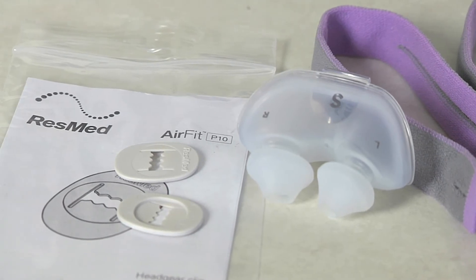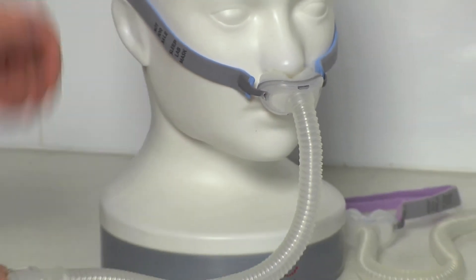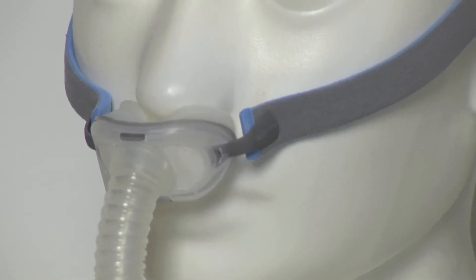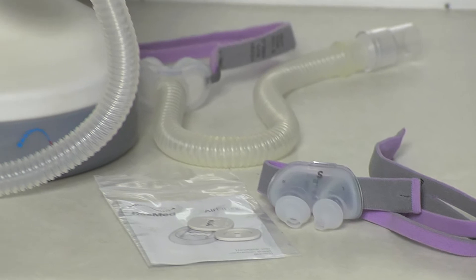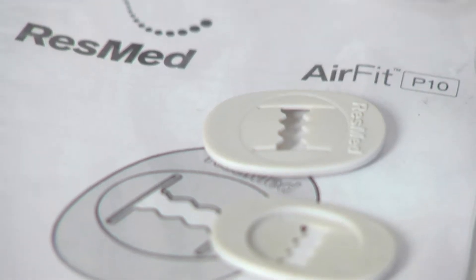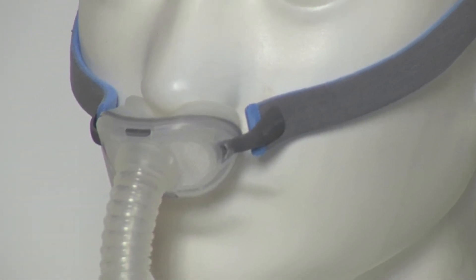Again, nice and easy to change over. Thirdly we've got the tubing and the frame of the mask. These parts are generally more durable, so what we have set up is a package where we can replace just the headgear, the pillow component of the mask, and we'll also give you some extra clips as well, which will allow you to tighten the mask and get a bit more wear out of that headgear.